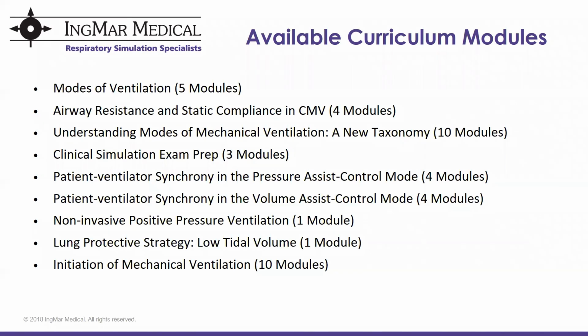So our next question here is, are the vital signs displayed on the vent or a computer screen? And if it is a computer screen, can you connect wirelessly? And so to answer the first question, the vital signs are displayed on our simulated vital signs monitor.